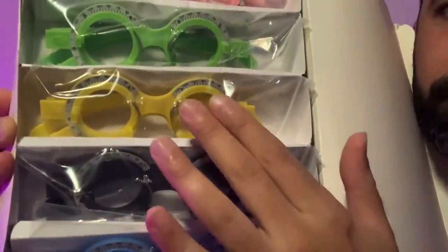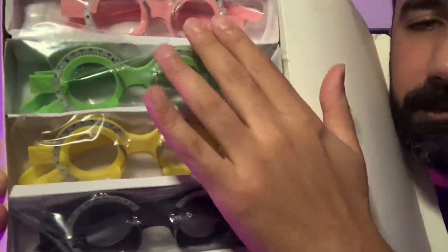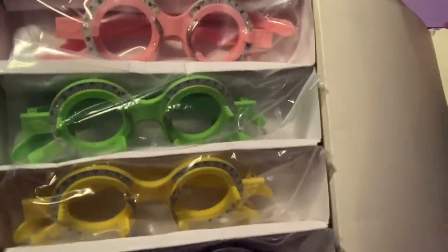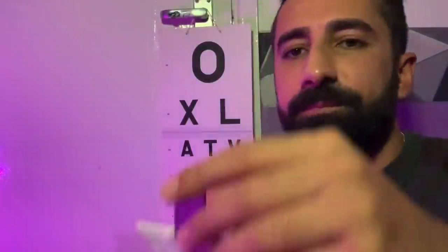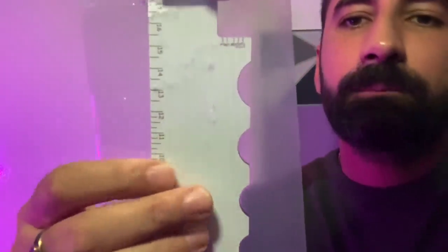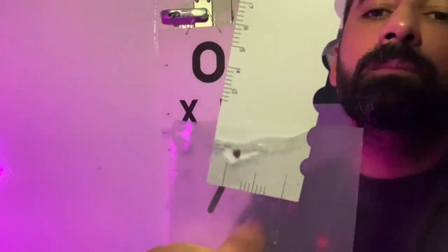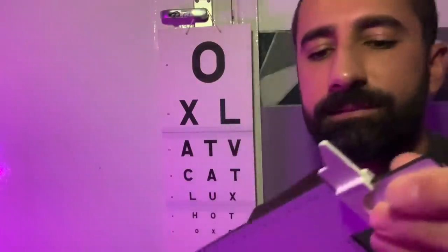They all go up in 2 millimeter increments. So before we place the trial frame on you, we take the interpupillary distance measurement. We're going to use this ruler here. Excellent. I'll just get it set up for you.